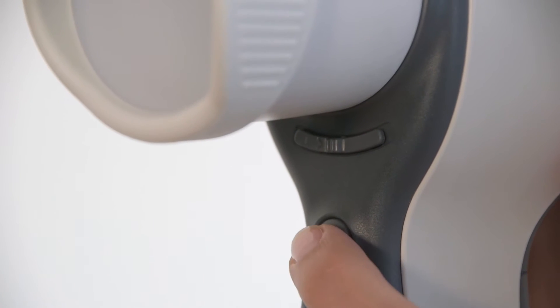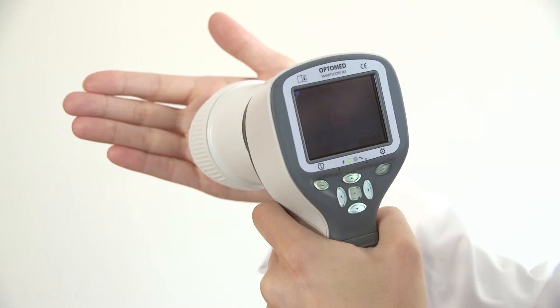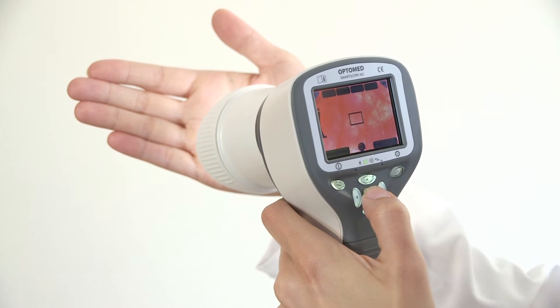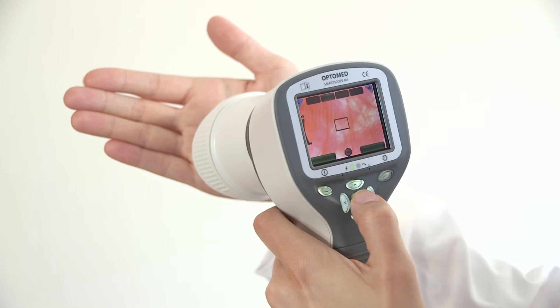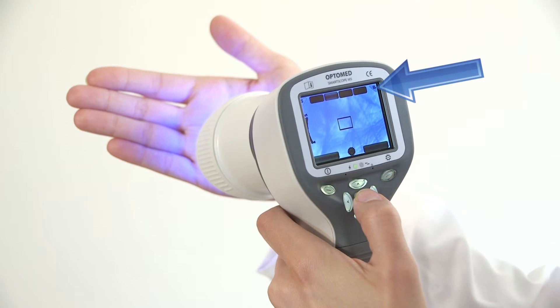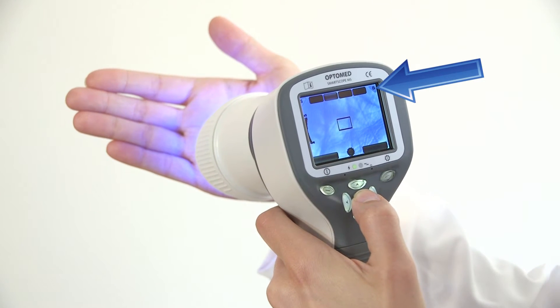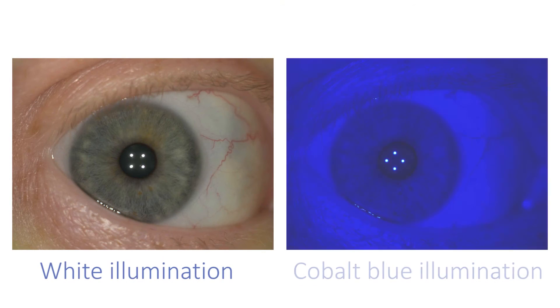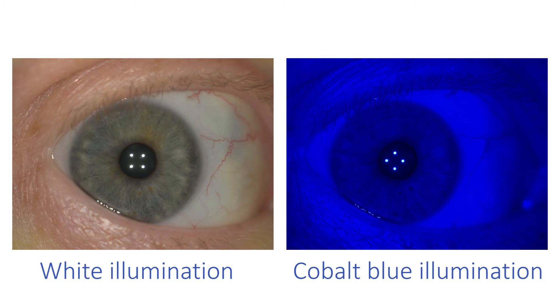Turn the light on by pressing the shutter button halfway down. The camera has two light sources: white and cobalt blue. Select the light source by pressing the middle key. An icon B or W will indicate the selected color of the light on the top right corner of the screen. Cobalt blue light enables taking fluorescent pictures of the eye surface.